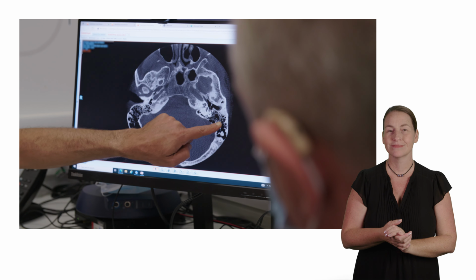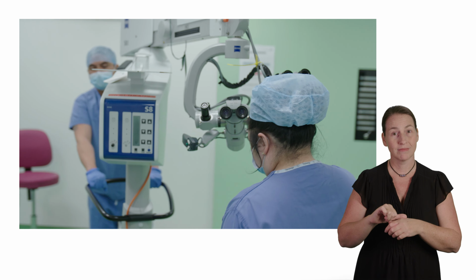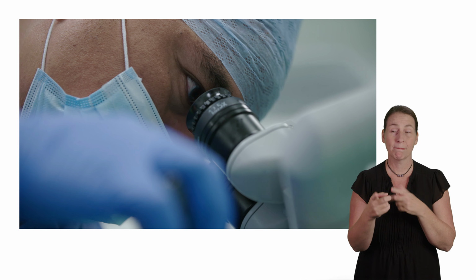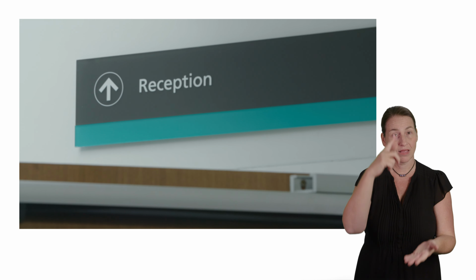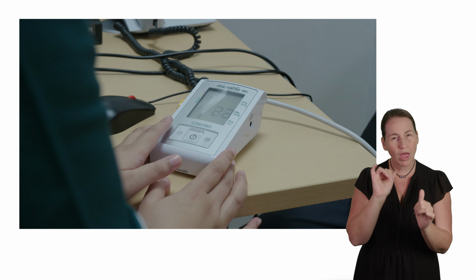At the outcome appointment, the surgeon would go through the preparation for surgery, the surgical procedure, and what to expect following the surgery. So cochlear implant surgery nowadays is relatively routine, straightforward surgery. Like any operation, there are some risks, and at your outcome appointment, we will be discussing with you your individual risks. If you decide that you would like to go ahead, we will arrange for a surgery date, and you will have a preoperative anesthetic assessment done to check your suitability to have a general anesthesia.